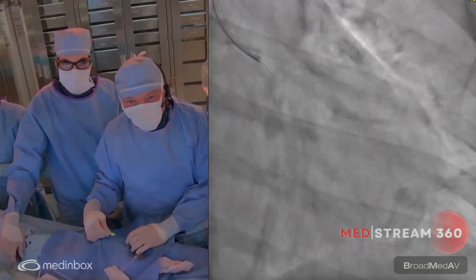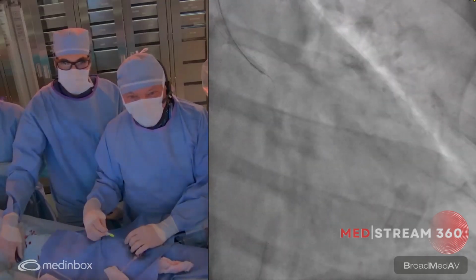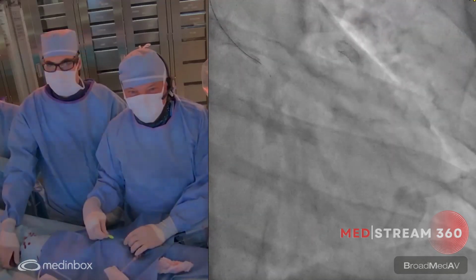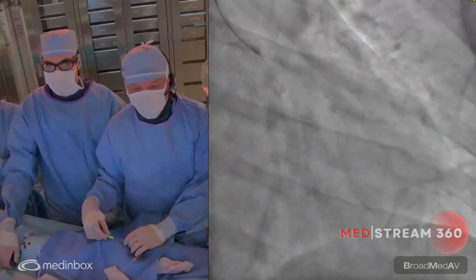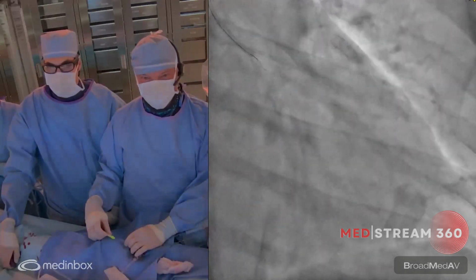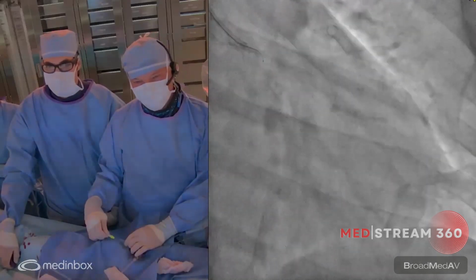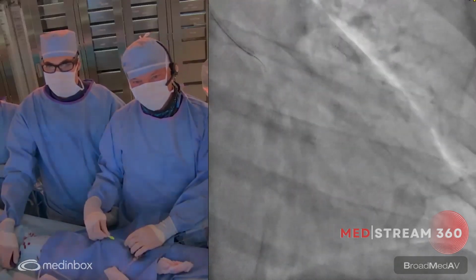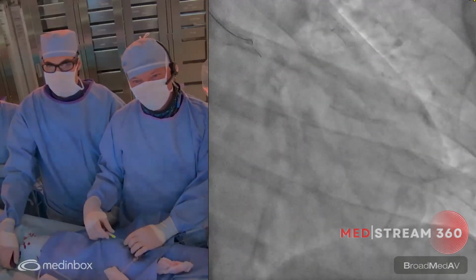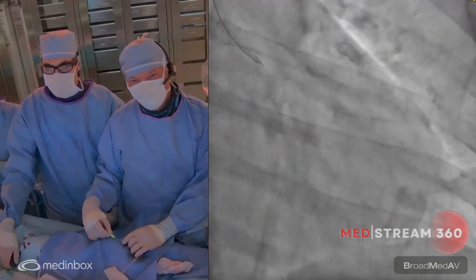He has lipid abnormalities. This is also important, I think, in this patient to try to modify the evolution or the recurrence of events. Now with the Fielder XT, I think it should track the microchannel better and hopefully have the strength. It's going through the circ, so it's easier now. It gives you more support with the guiding and the wire. For this, you have to be patient. It's nothing to be rushed. He has no pain. It's very stable.